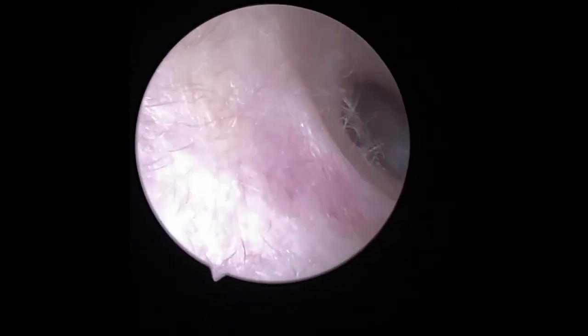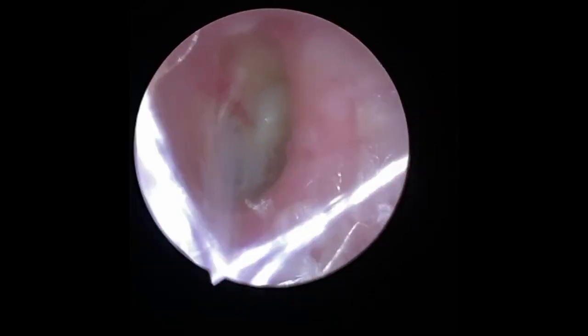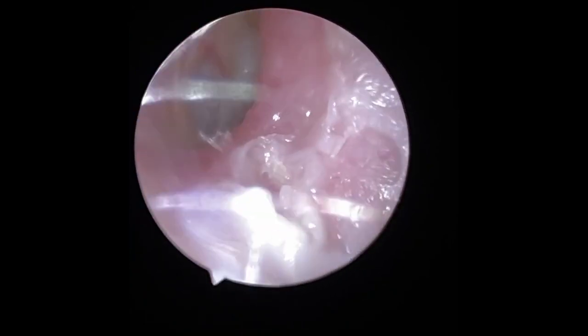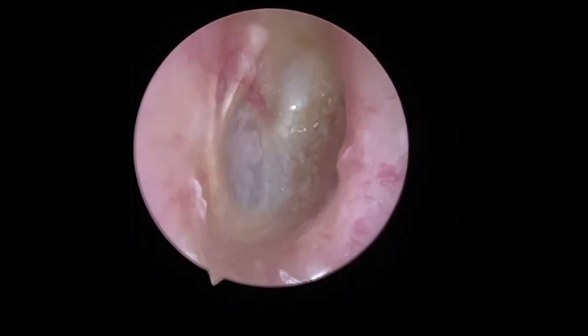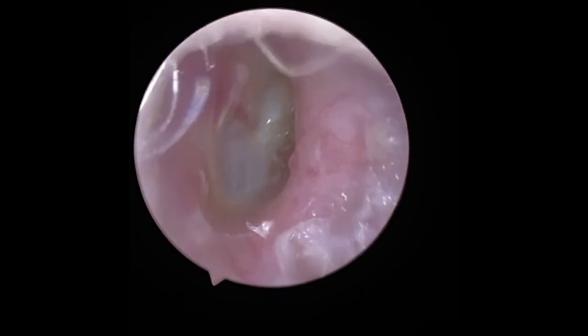Here's the final shot of the eardrum and ear canal after the procedure. There was part of the procedure I didn't film called irrigation, where I used a light steady stream of water to try and dislodge the last bit of earwax on the right side from the eardrum, but it didn't want to come away. Aria was super pleased that the pain from the blockage was completely gone and she was able to hear clearly already, so I stopped the procedure.